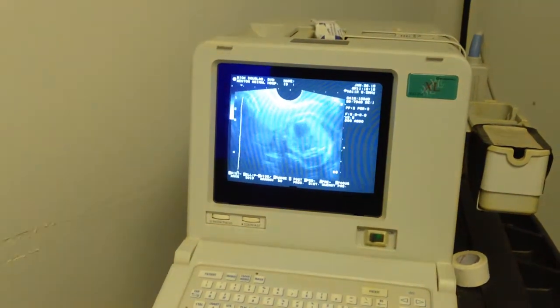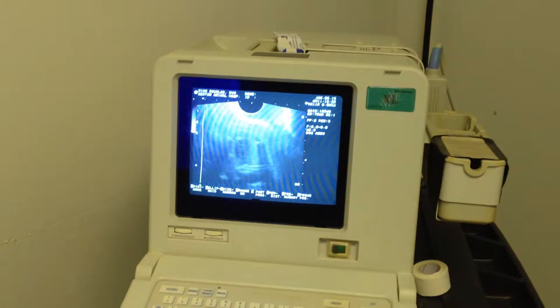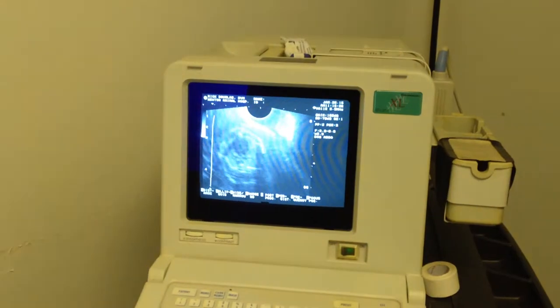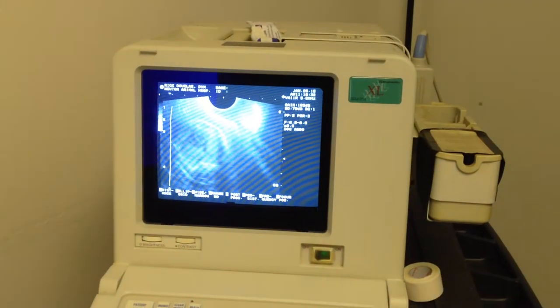So we know both puppies are live. Can we tell the size of the puppy? It's kind of hard. Yeah, on ultrasound, it's difficult. See, you got a picture there? Yeah.